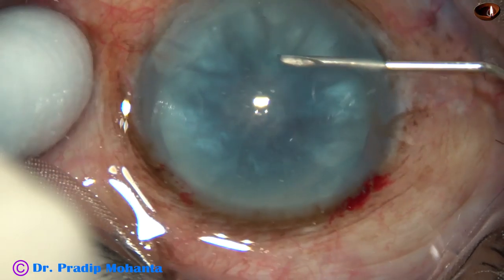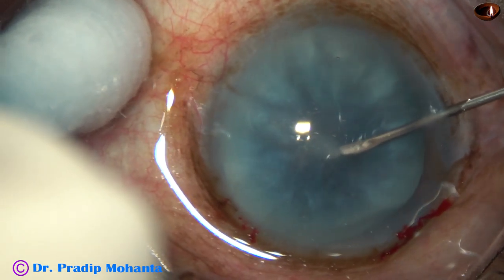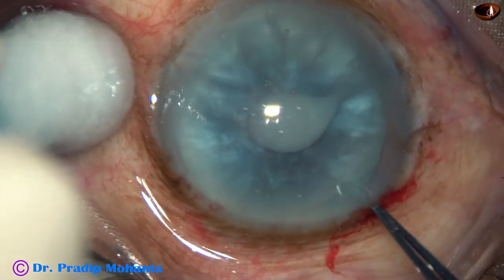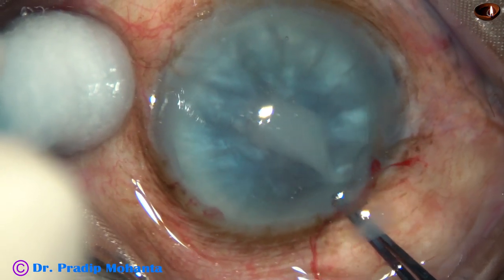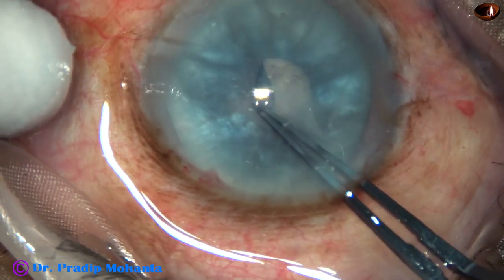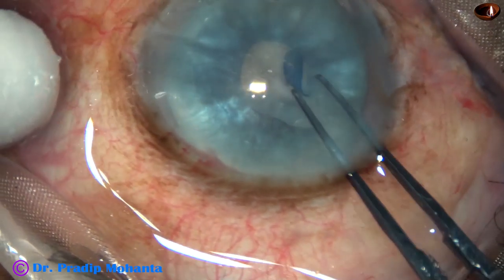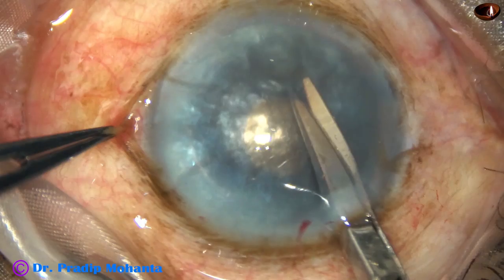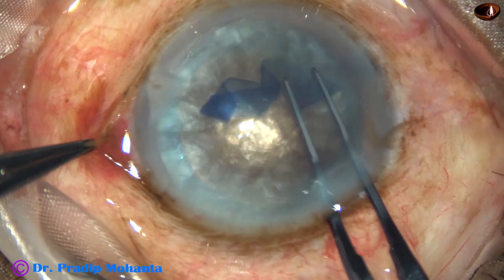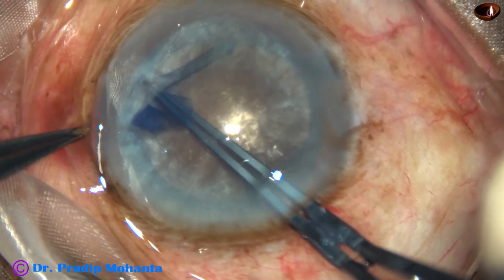This is another hypermature Morgagnian cataract. The anterior capsule is incised. Milky fluid comes out. Then I used the Utrata forceps to make a small rhexis first. Then I used Simcoe to aspirate cortex. Inject visco, make a cut at the margin of the rhexis and enlarge the rhexis into an optimum-sized large rhexis.